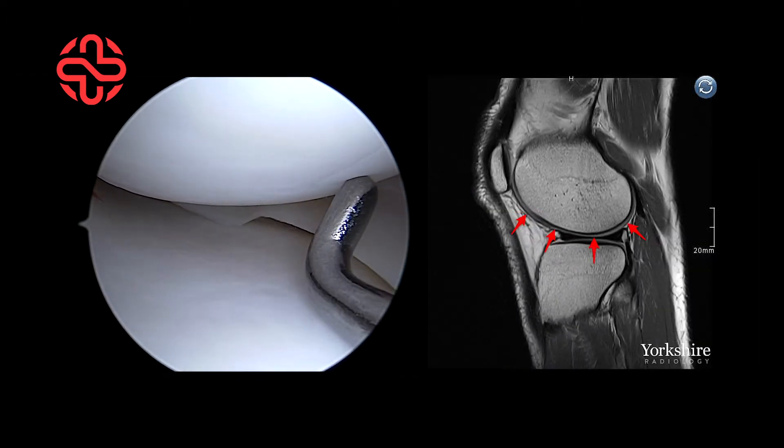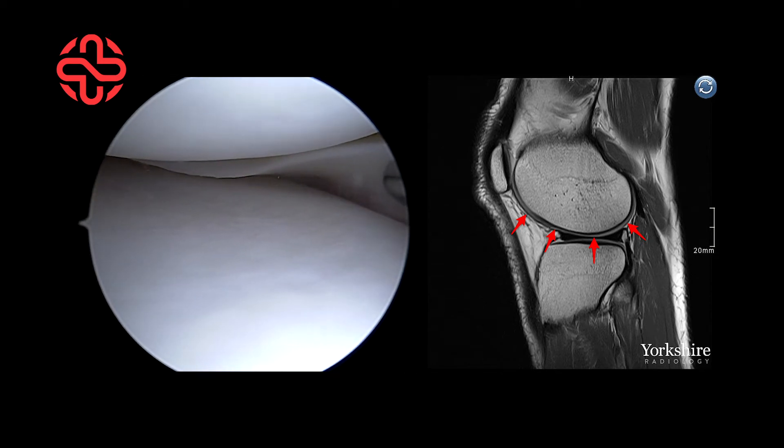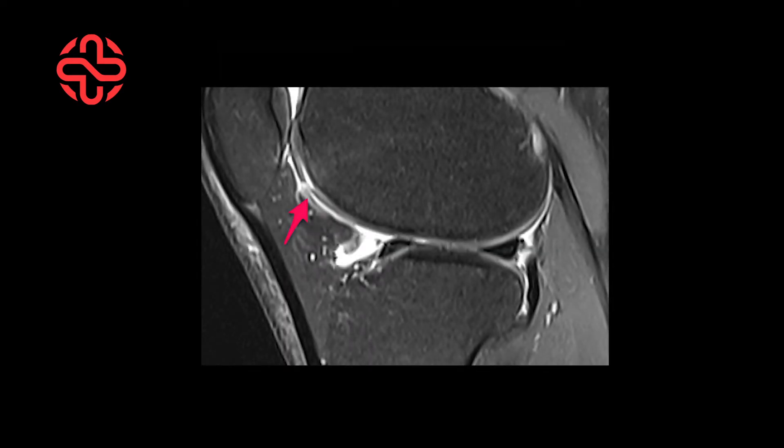This cartilage can be injured, sometimes separating from the underlying bone and creating a loose flap. A full thickness chondral fissure on the retropatellar surface is shown with this T2 fat suppressed axial image. On this sagittal image, the grey chondral surface has separated from the underlying bone, with the white fluid signal seen between the two surfaces.